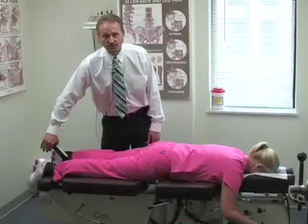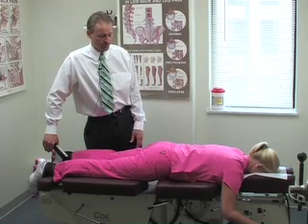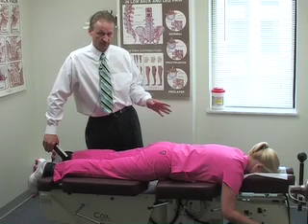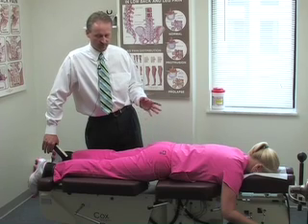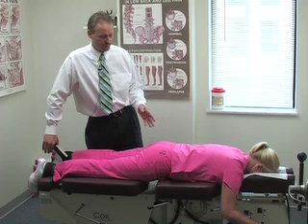What I'd like to do is introduce you to a technique called flexion distraction therapy. As the name implies, we utilize flexion and distraction simultaneously. It can be applied to the cervical spine. We're going to demonstrate with the lumbar spine. Very effective for various conditions, especially disc conditions, but also stenotic conditions of the canal and so forth.